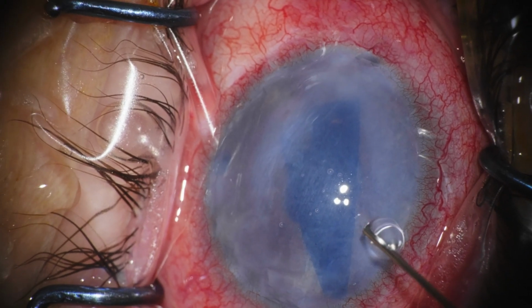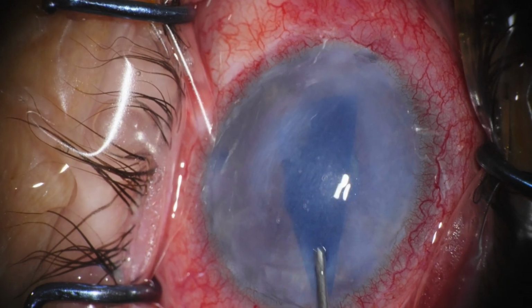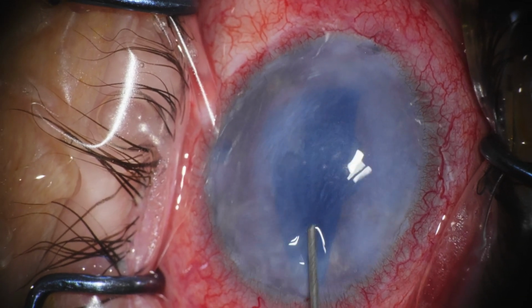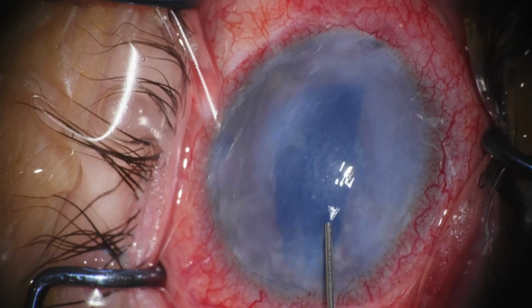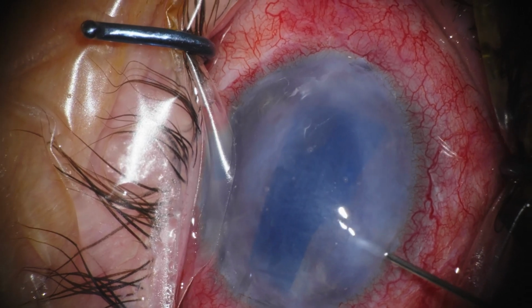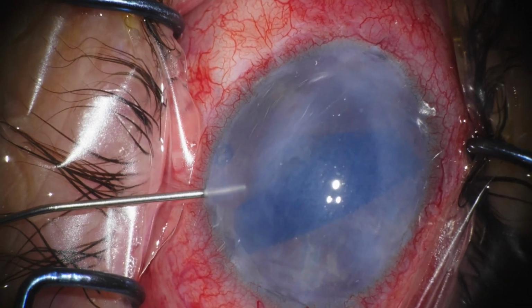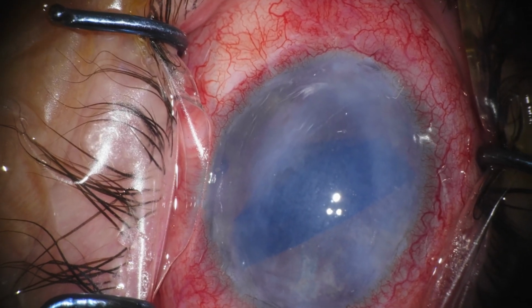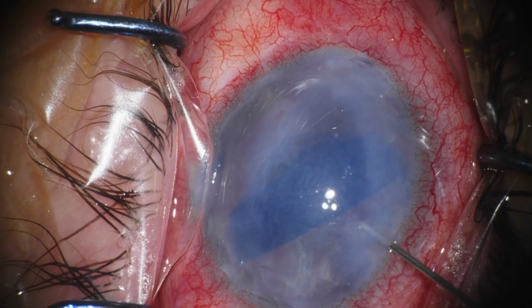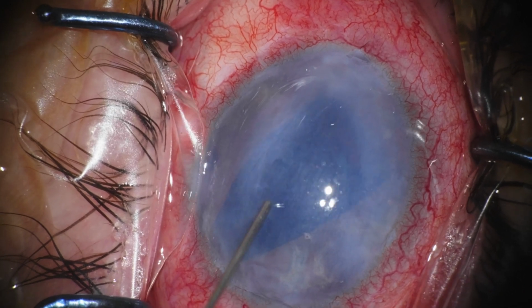So the graft is in a bouquet configuration right now, pinned against the temporal angle. We're deepening the chamber a bit. It doesn't want to deepen too much, so we're not wasting time on overinflating the chamber. And we appreciate that the graft was upside down. So now we're flipping it. It wants to follow us to the paracentesis. We move it out of the way, and then we're constantly trying to deepen the chamber as little as possible.